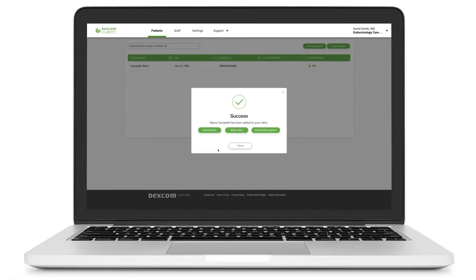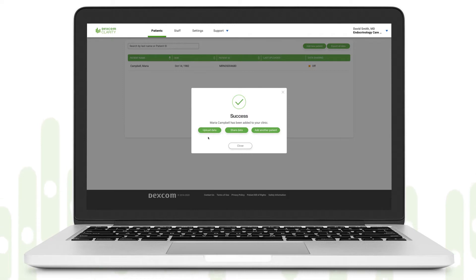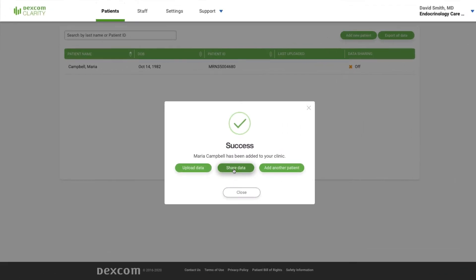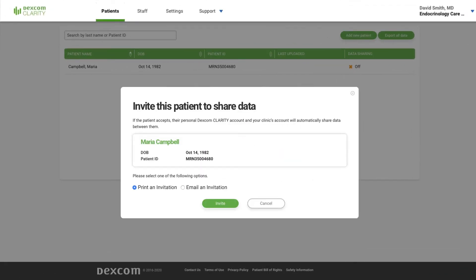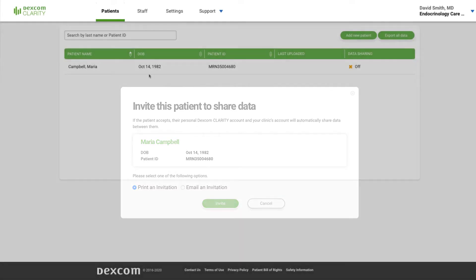Here you can upload the data from the patient's receiver, or for patients using the Dexcom CGM app on a smart device, invite them to share data to automatically and continuously send their glucose data to Clarity for you to view anytime.